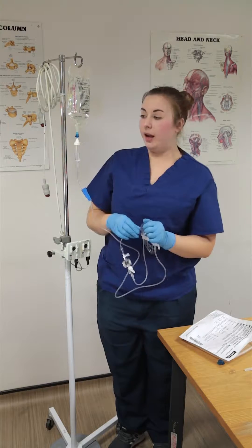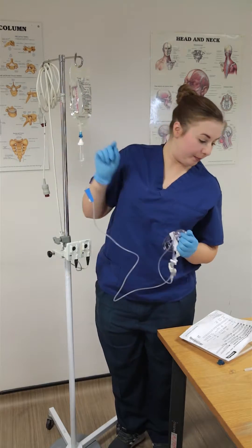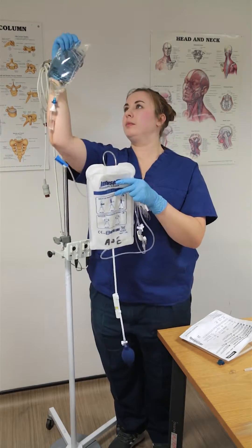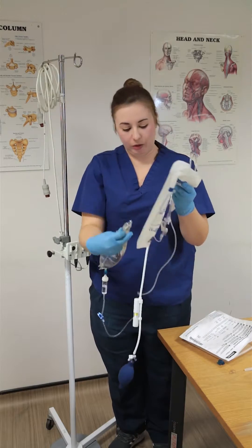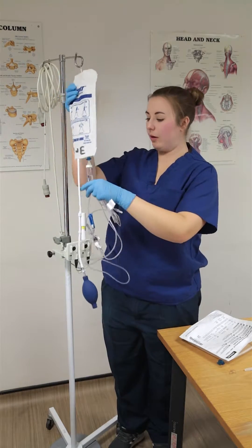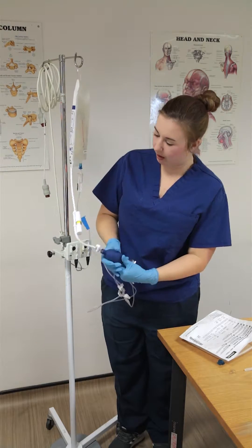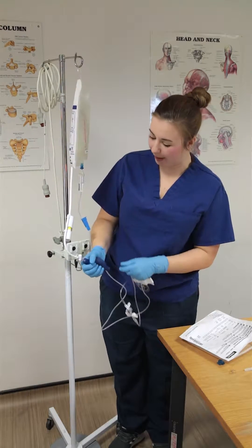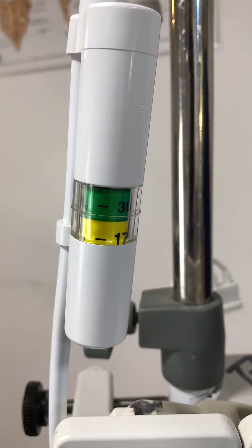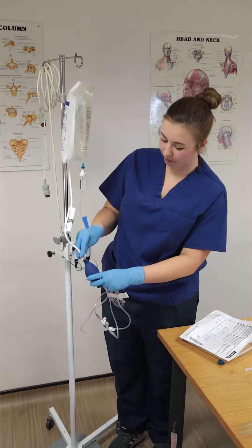What I'm going to do next is pressurise my fluid bag. So I take my 500ml pressure bag, pop it off — it has a little handy hook on the inside — and hook that one on instead. Using the squeezy end I'm going to put some pressure into my bag. I want to pressure it until this bit goes green. I've got enough pressure in my bag now and I'll just lock that off.